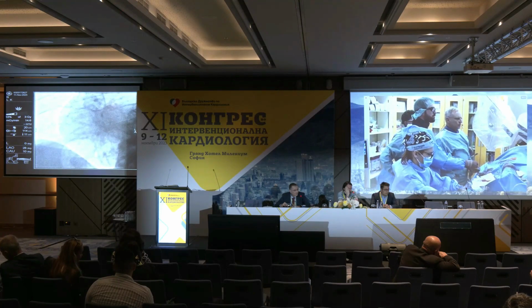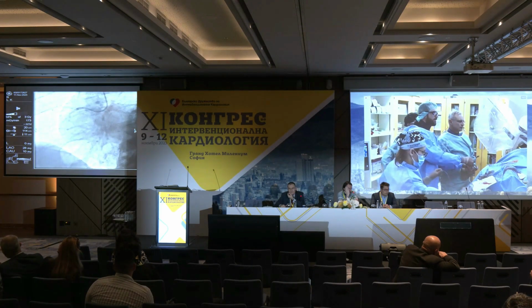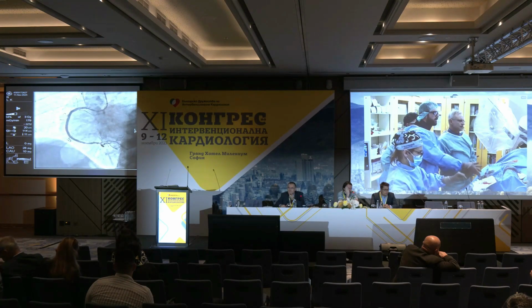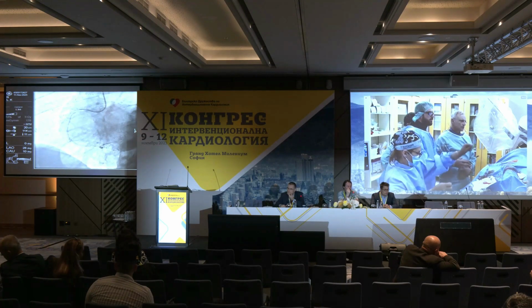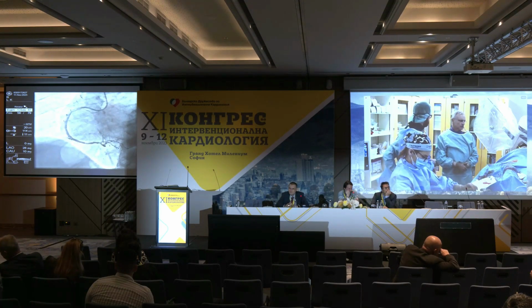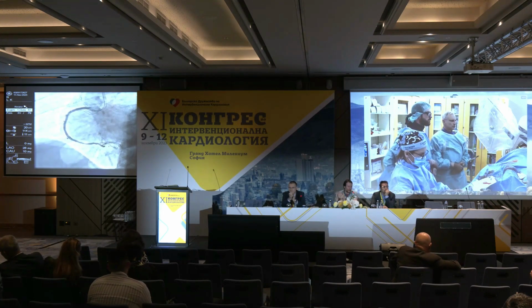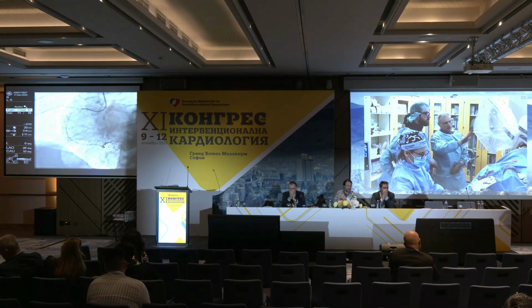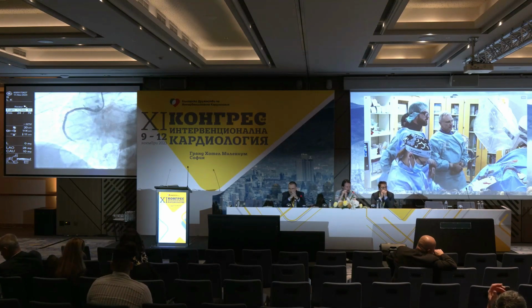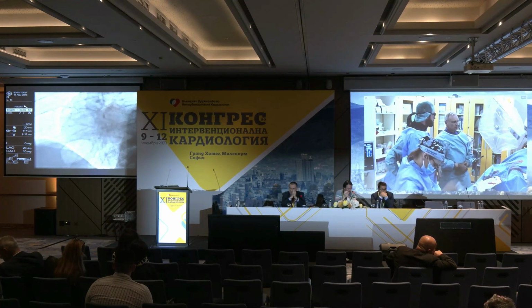So we have one more minute. Let's make one final film. I think we finished here. The situation remains stable. There is no pericardial effusion. In my view, we can consider that as a successful and uncomplicated procedure, always having the caveat. The stenting in the ostium is very good. You can clearly see that we covered the ostium. There is a good backflow. It's not too out, it's not too in.